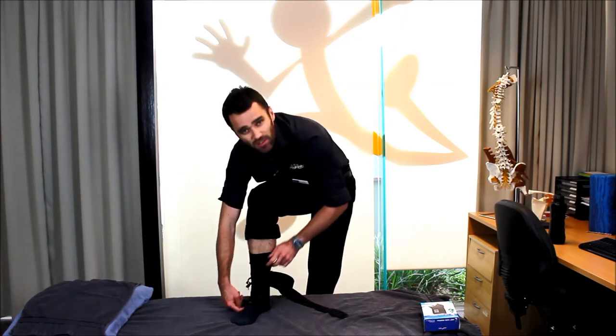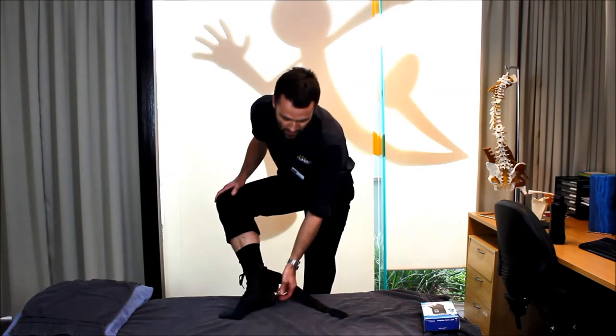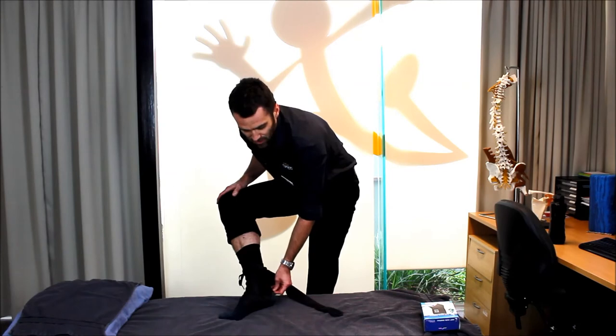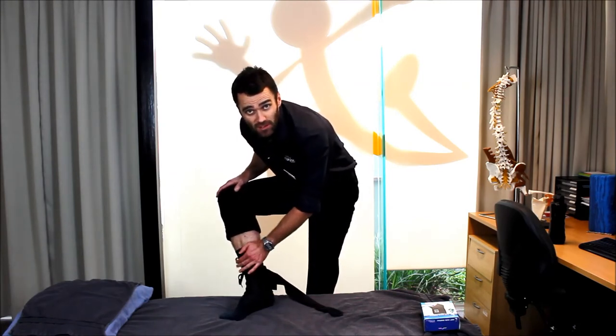You can add a stretch — just slide a finger up underneath the seam — and it feels nice and snug. If we turn around, one of the key things is that the heel itself is not going to rub, but of course your heel isn't slopping about in there either. It feels nice and snug.